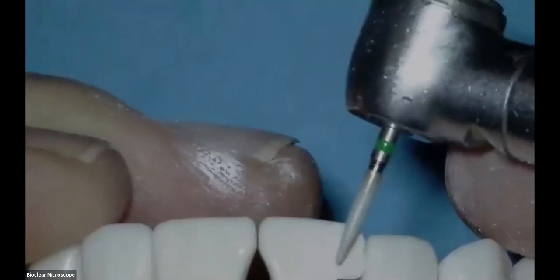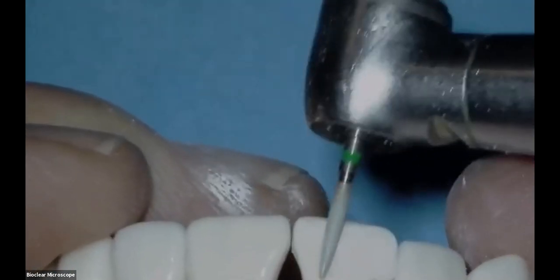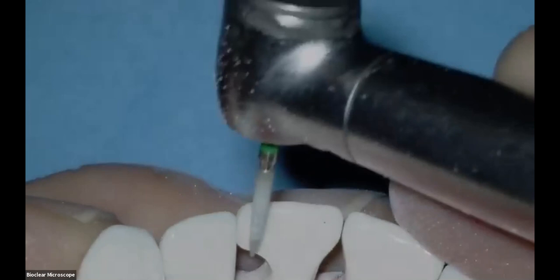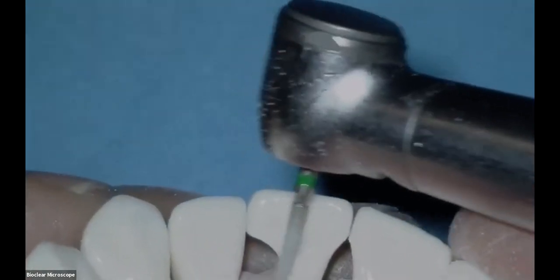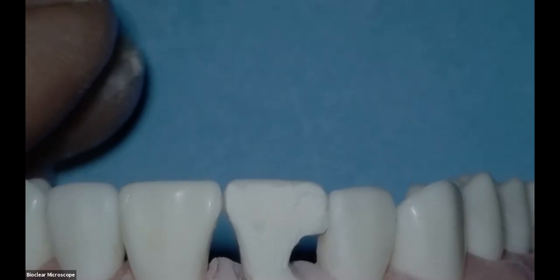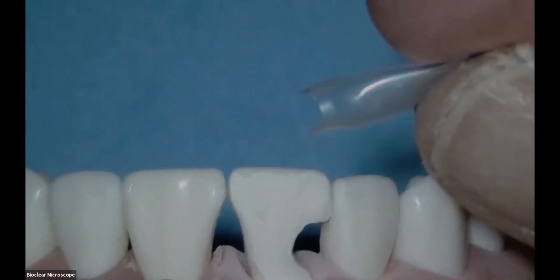Now I'm just going to scratch all of this tooth up so I can get the composite to stick to the dentiform tooth. Once again, I don't prep the tooth clinically. We just use disclosing and blasting. So I'm just cleaning all this. I'm just getting the glaze off of my tooth. So we're going to go ahead and do the one tooth here. I'm going to injection mold that and quickly sculpt that. So now we're ready to injection mold.